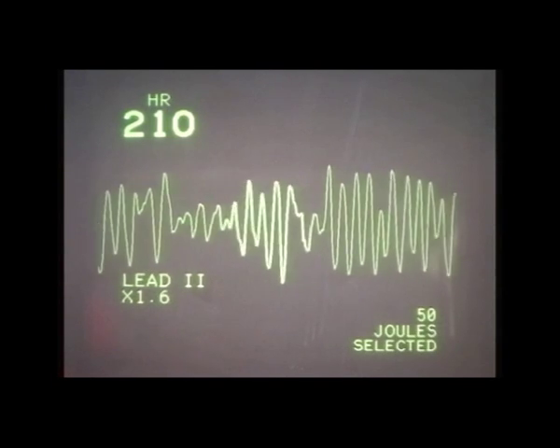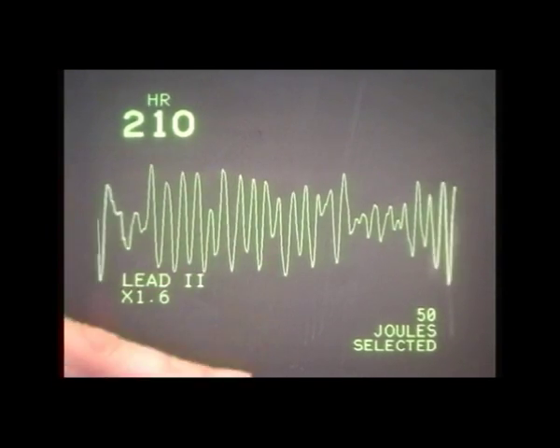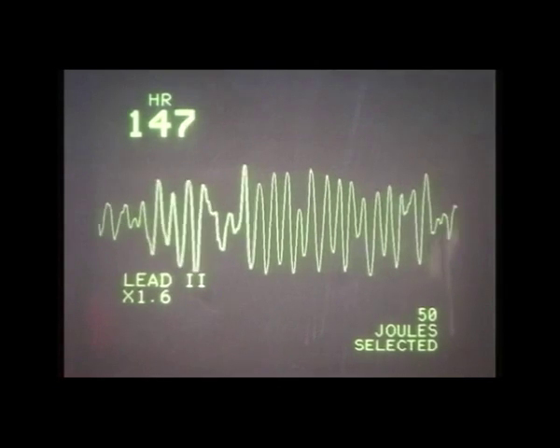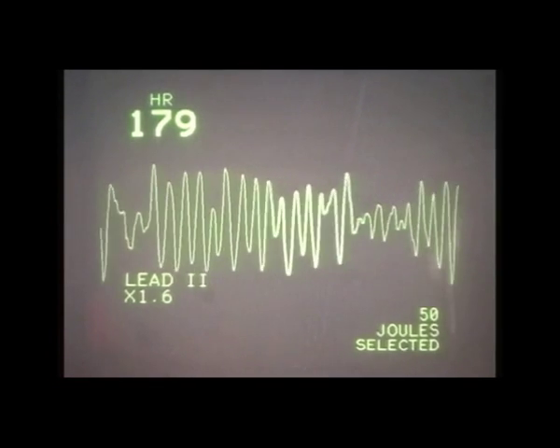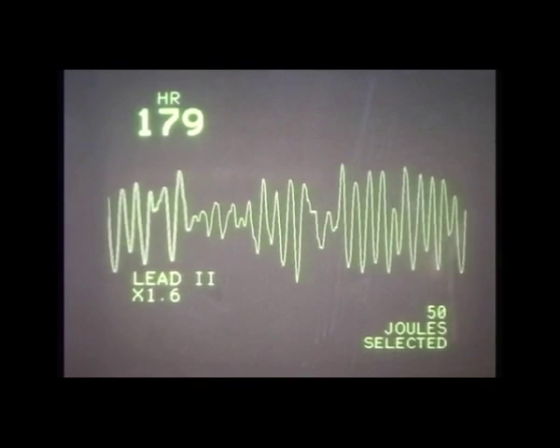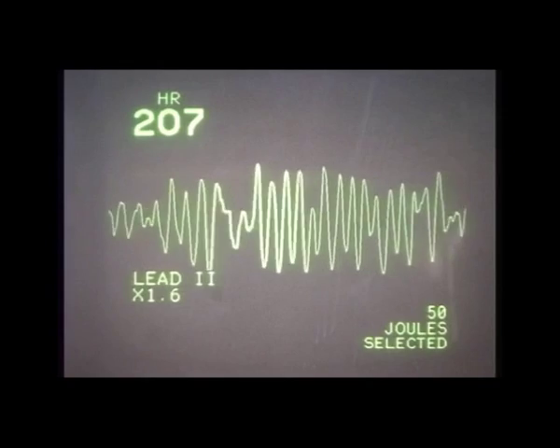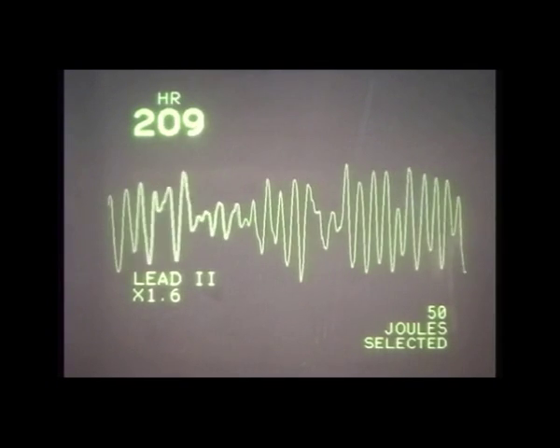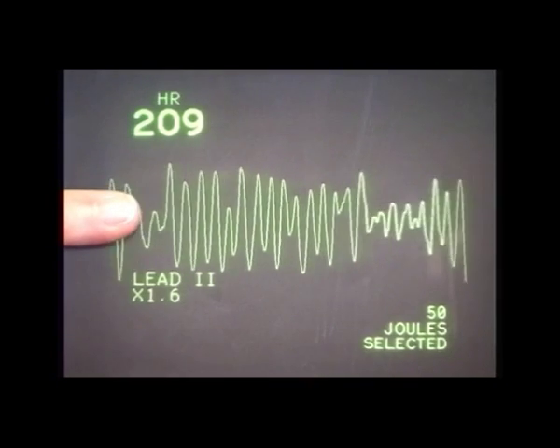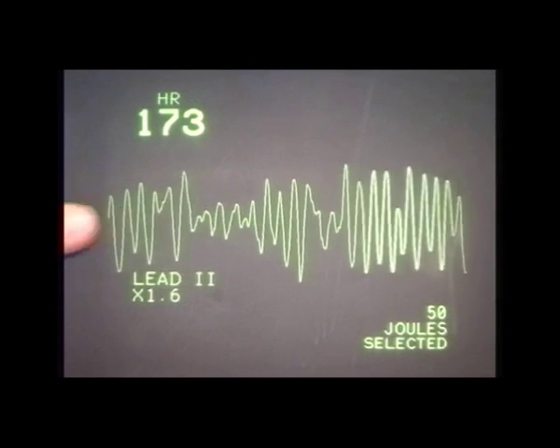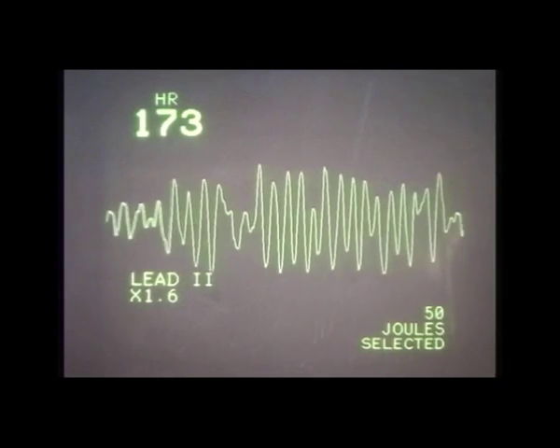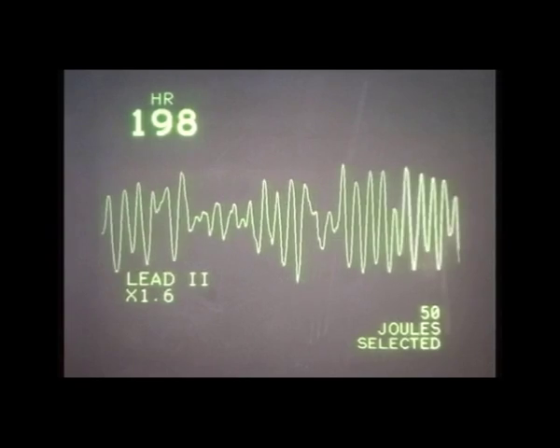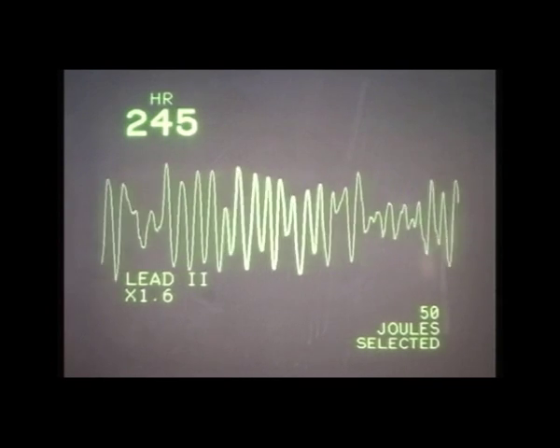It is, yes. And there seems to be quite a lot of deflection here. It's a fairly coarse rhythm. Although, eventually this will lead to a fine ventricular fibrillation, and then on to asystole. So, you're more likely to see this early on in the arrest? Yes. This rhythm would have a far better prognosis than fine VF, providing it was defibrillated.